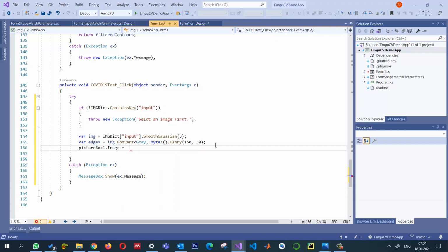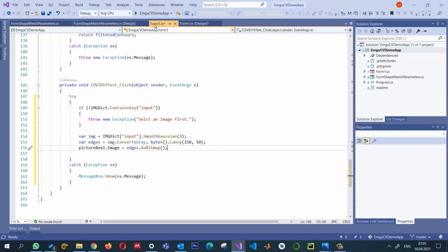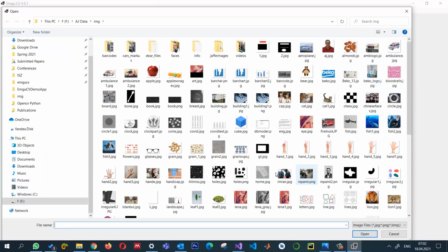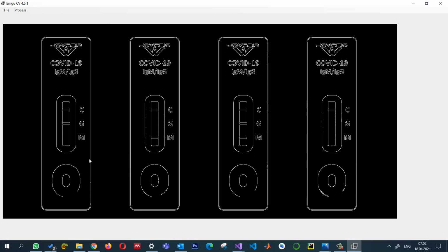And we can look at the results actually. img is equal to edges.Image to bitmap, and then let's see what actually it gives us. And when we click on COVID-19 test, perfect. So the edges that I wanted to find are over here, and we can also do some dilation if there are some small edges somewhere or small elements.